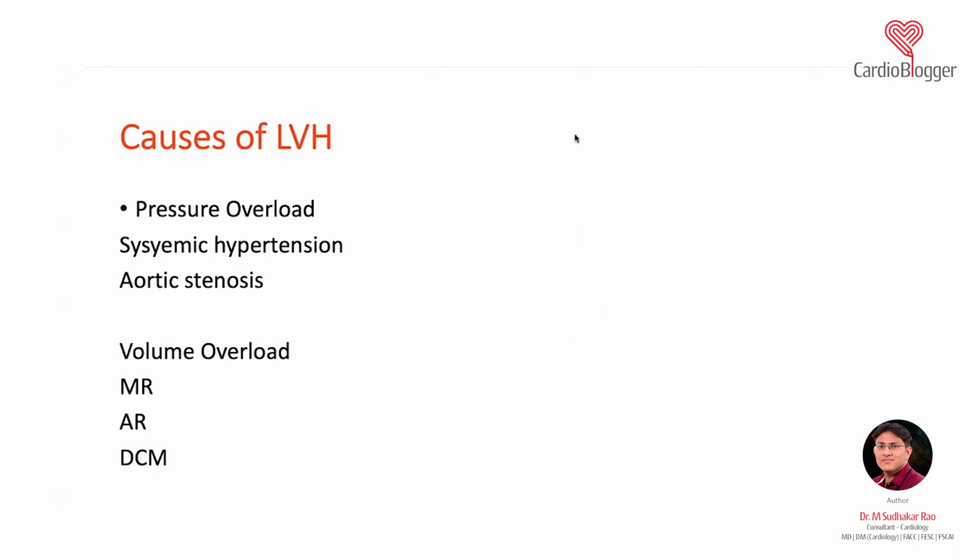Right. Sir, we have one question. Are heart failure and LVH the same? No. See, heart failure is a clinical diagnosis. LVH is an ECG diagnosis. Many diseases with LVH can present with heart failure, like hypertension and aortic stenosis. Mitral regurgitation and aortic regurgitation, which can cause LVH with volume overload, can also present with heart failure, but they are not synonymous. Heart failure is a clinical diagnosis, LVH is an electrocardiographic diagnosis.